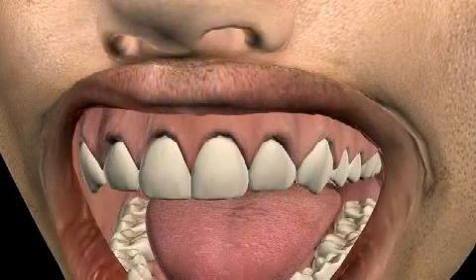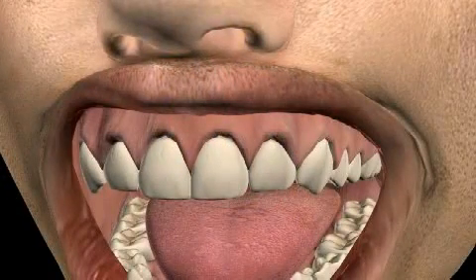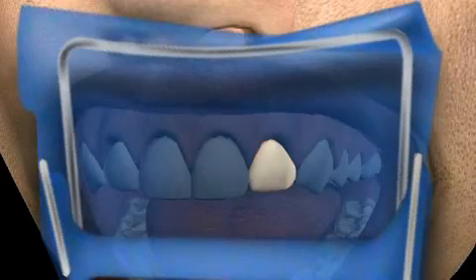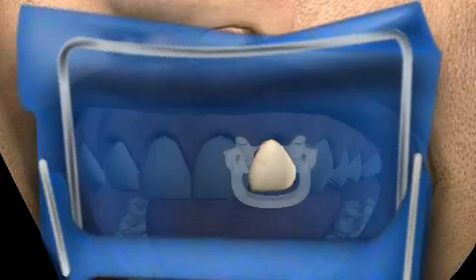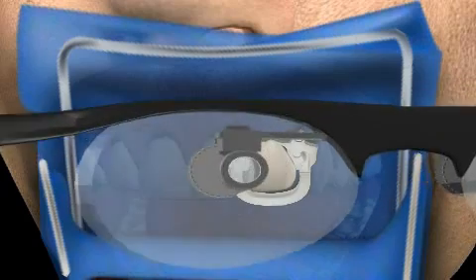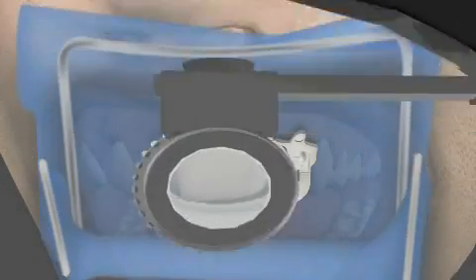The work requires a rubber dam, a microscope, and patience, and takes a long time. This is surely one of the reasons why a root tip resection is often chosen over a revision.